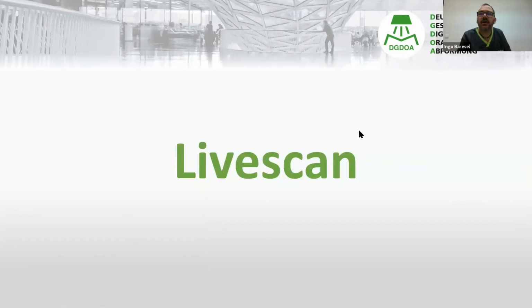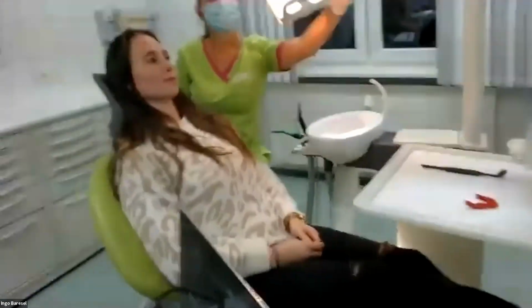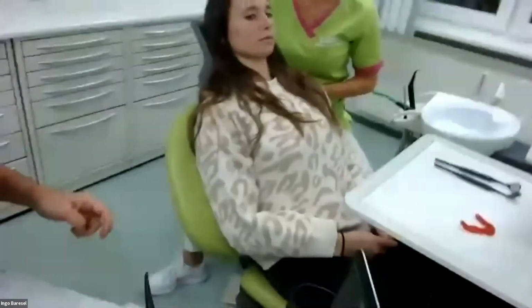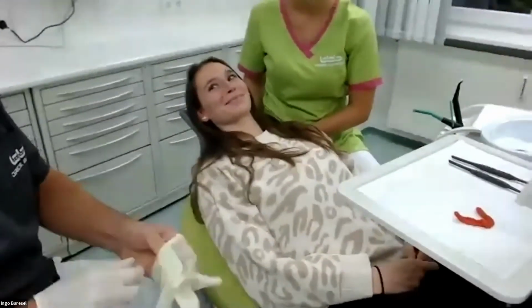So I will stop sharing my screen, and we now go to the camera. So we go to the camera, and I hope all this works. We have a patient on the chair. So I hope you can hear me. Thank you for being our patient today.